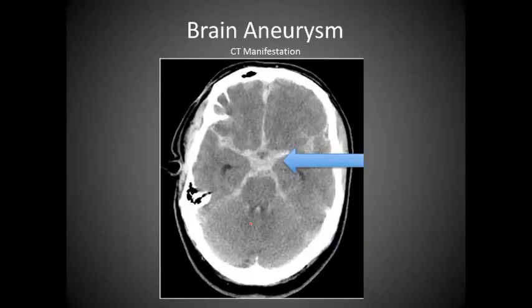of diagnosing. Here's an aneurysm rupture once again. It looks like subarachnoid hemorrhage. We have blood going all the way through the circle of Willis, kind of filling in these spaces. Looks almost like we've injected with contrast. However, it's safe to presume that we had not injected with contrast here.